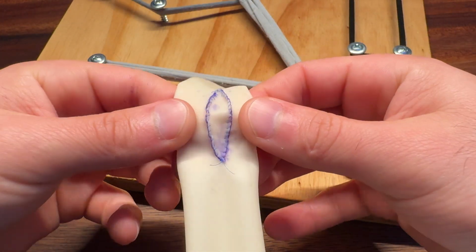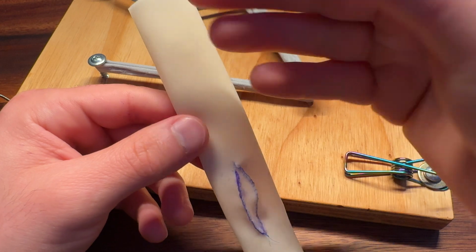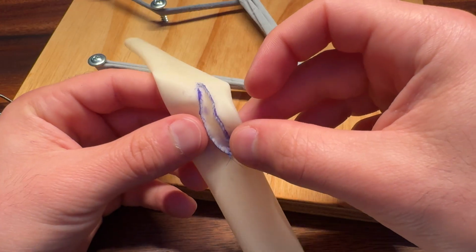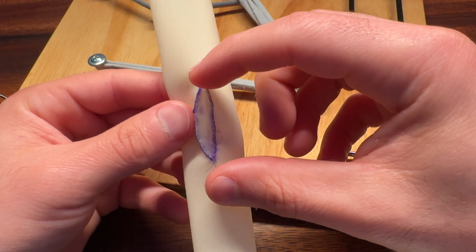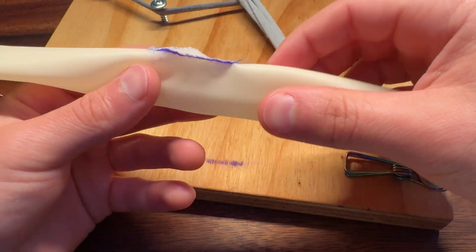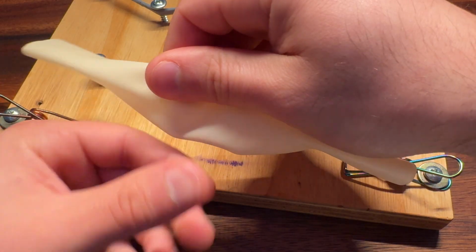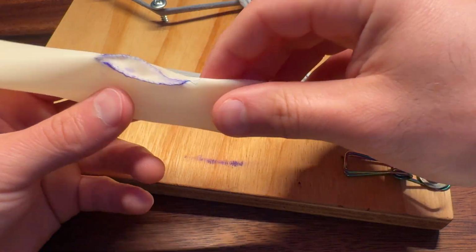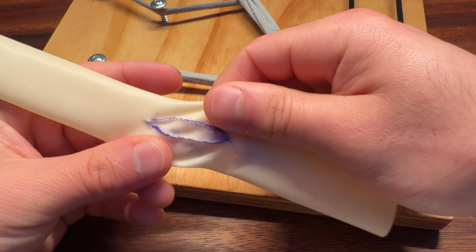It is a bit tricky, but this is how it came out. It does kind of cave in, but I think it's because the Penrose tubing material is pretty elastic. In real life, the blood vessels are soft and pliable, so it accommodates this and it looks better, right? But essentially, we accomplish the goal of maintaining blood flow through the blood vessel without compromising resistance, right? Otherwise, we're going to create a smaller lumen here for blood to flow through, and that's not going to allow for the proper dynamics of blood flow. So this is going to maintain that in a blood vessel type of scenario.